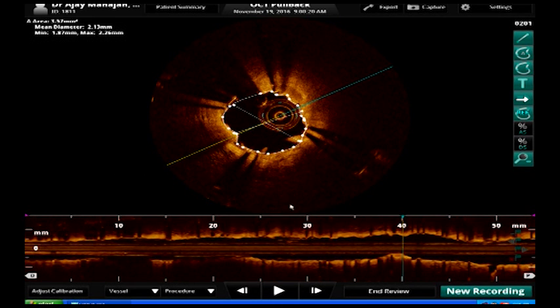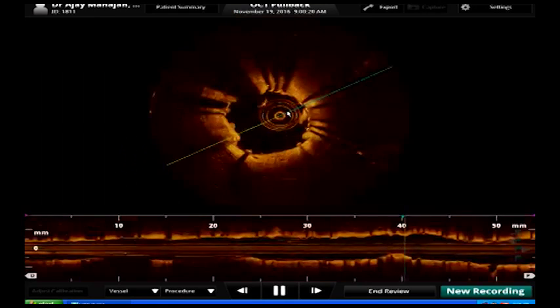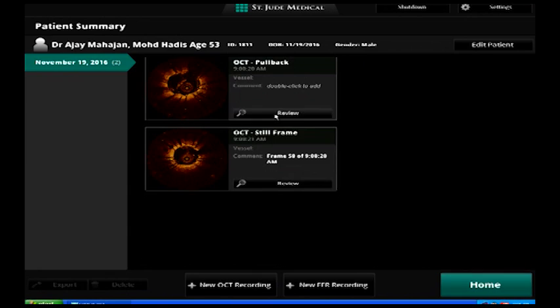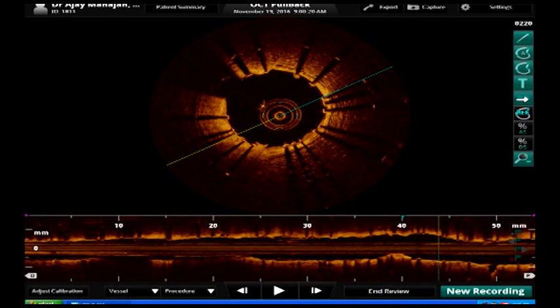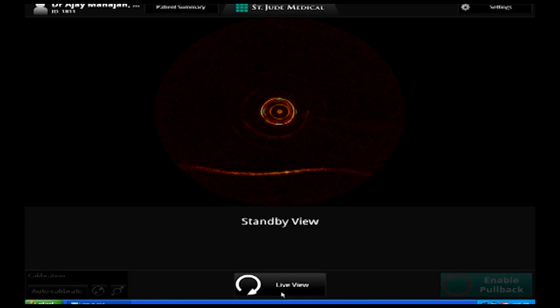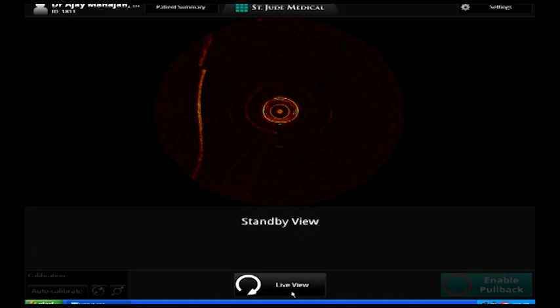Which also makes a point for the debulking, like Dr. Deepak was saying. Sometimes when there's so much calcium, once you put the stent in, you're stuck with no option but to try post-dilatation with the non-compliant balloon. Whereas if he knew beforehand that the calcium was quite severe, maybe debulking would help him at this stage. That's called stent regret. I think we should go for OCT now.